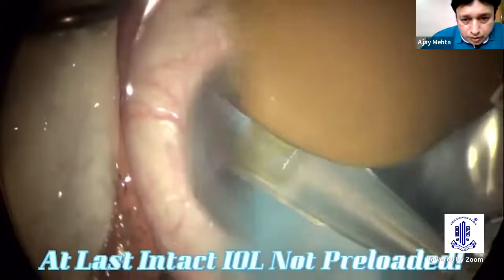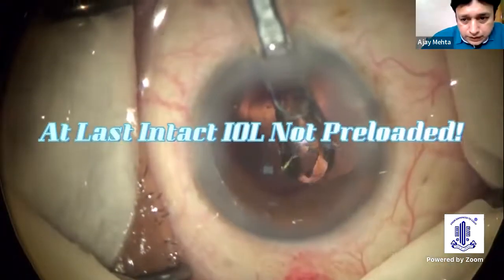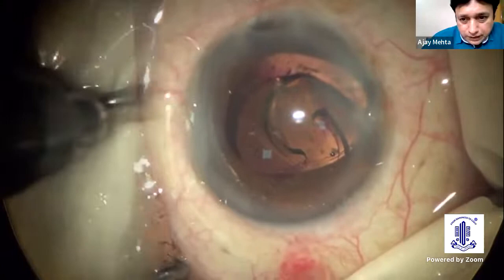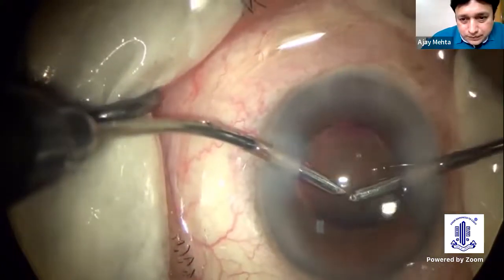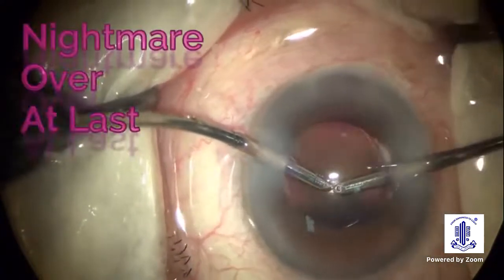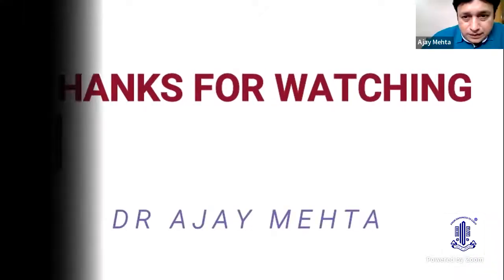Then with all the confidence, an intact IOL was delivered in the bag. Ultimately, the patient could achieve very good vision even the next post-operative day. And this is how the surgery ended. Hence, it's necessary to keep all this in mind for a good cataract surgeon. Thank you for your kind attention.